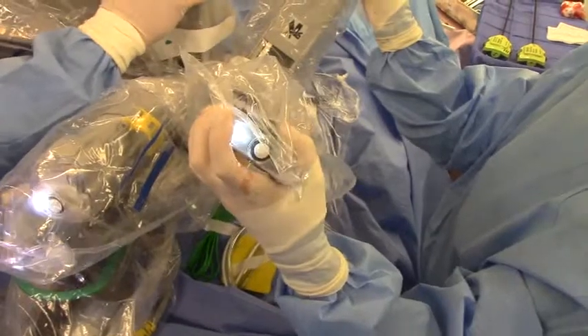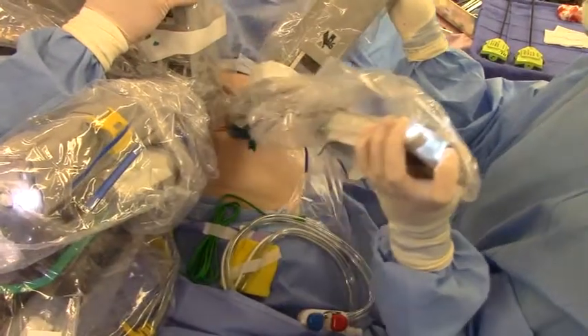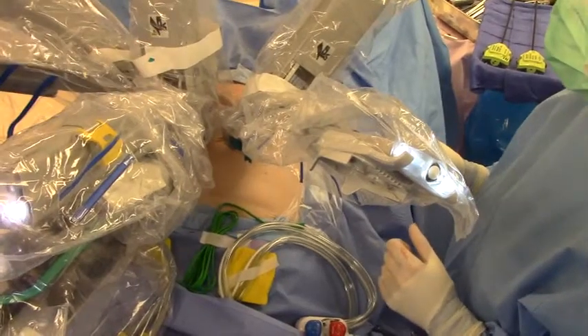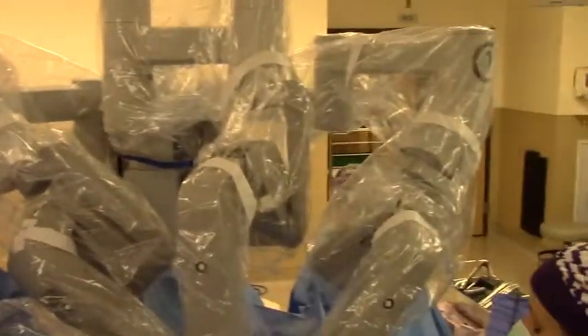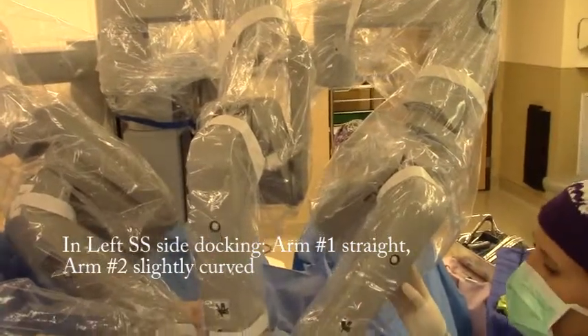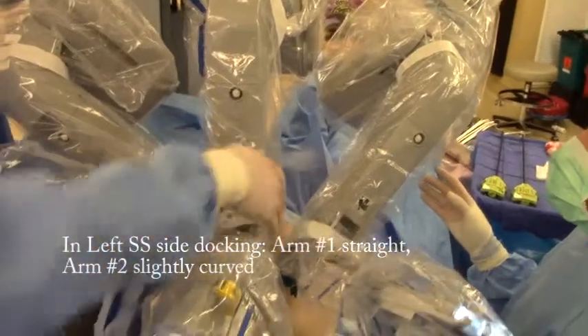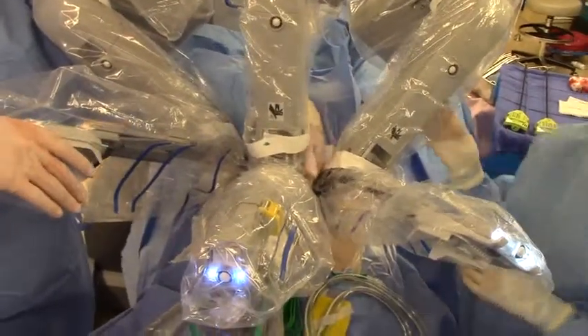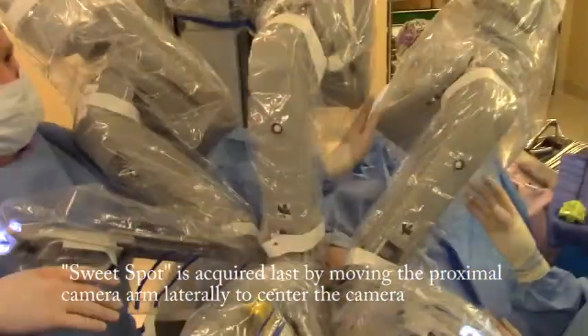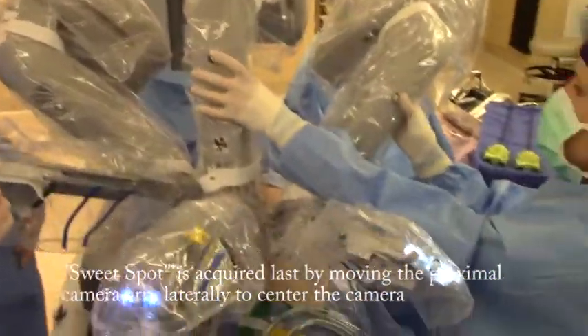You've got the Frankenstein arm. Not exactly Frankenstein — this is going to have a little bit of a curve right here. But what you want to do is make sure that you can slip a hand in between these elbows here, these joints here, and that there's room between these elbows. That should give you all the mobility that you need.